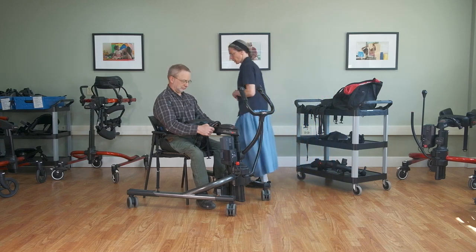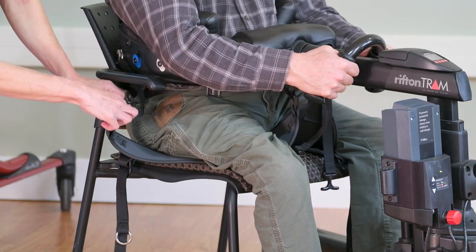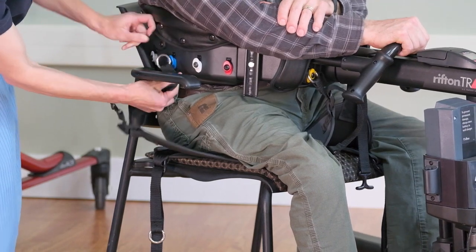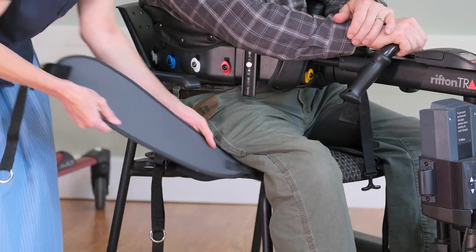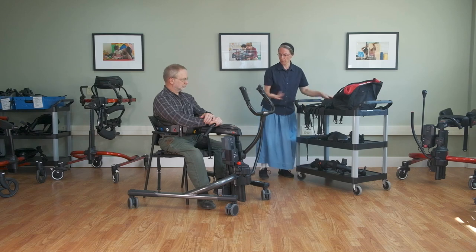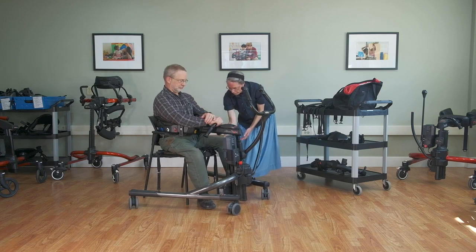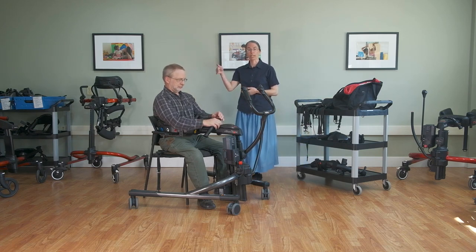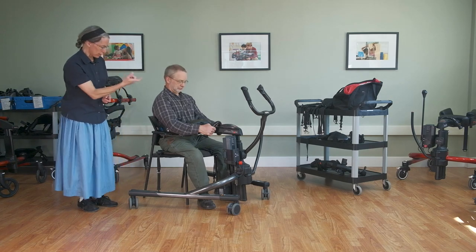Now we're going to remove the thigh straps. There's a nice little plastic triangle that you can pull on to lengthen the strap, which makes it easy to unclip — we'll do that on both ends. Note that the saddle was placed with the gray side up so that the smooth surface is up, making it easy to slide under and slide out. For the walking saddle, we'll use the clips along the side of the body support system — only the thigh straps use the yellow clips at the front.